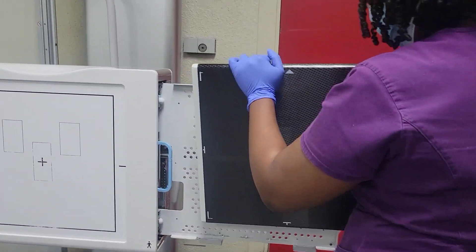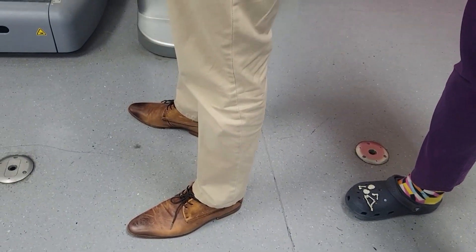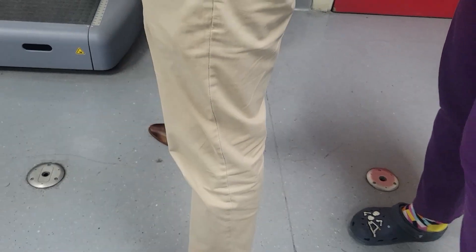The first thing you want to ensure is that the patient is standing with feet shoulder-width apart. A lot of times patients tend to stand with both feet together, especially if they aren't feeling well. In many cases patients needing a lateral chest x-ray may already have conditions like fluid in the lungs, so they may be swaying. Having feet shoulder-width apart helps minimize motion and gives them better stability.